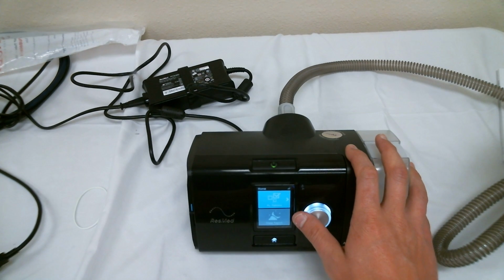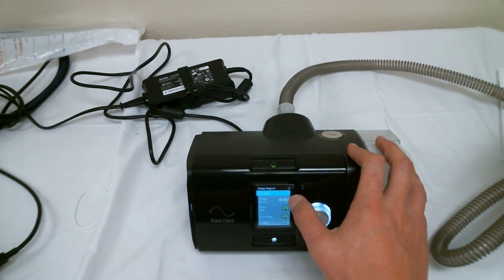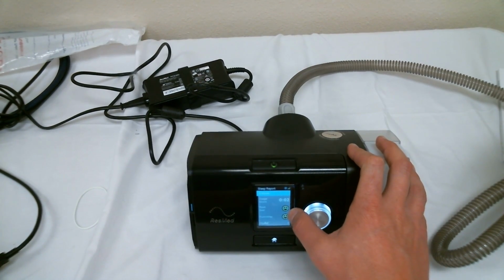The last selection on your menu is the sleep report. This will give you an overview of your previous night, including usage hours, mask seal, and humidifier function.